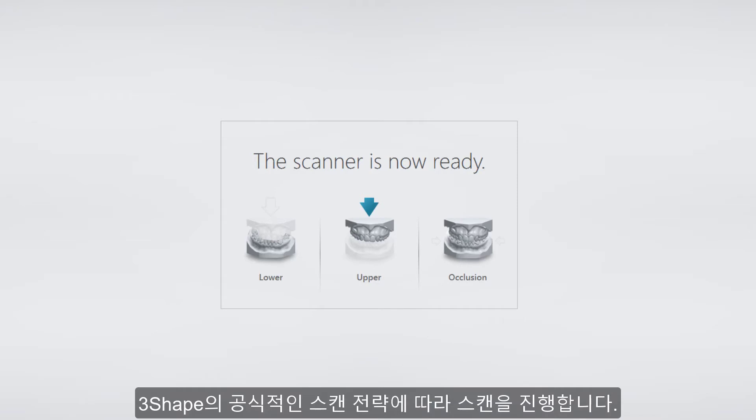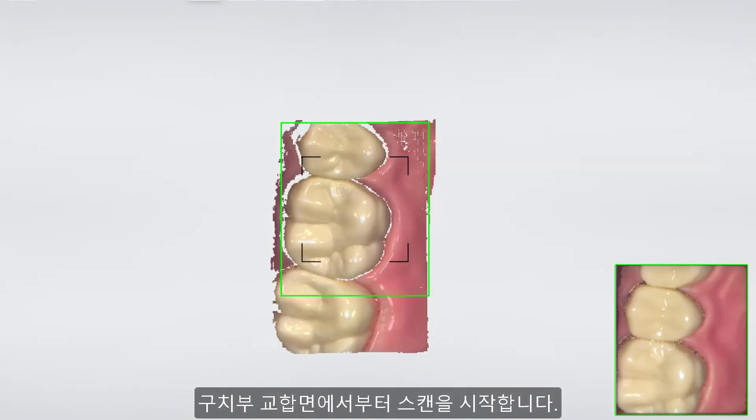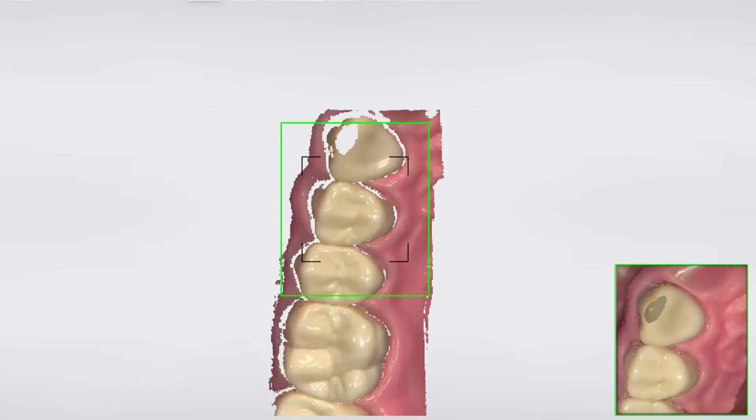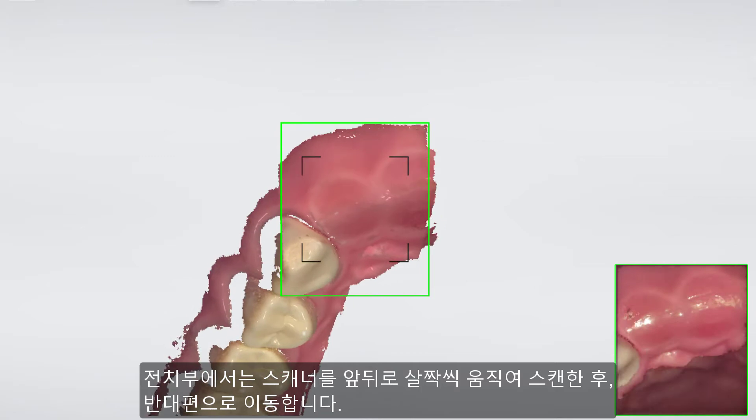Start scanning using the official scan strategy. Start from the posterior area on the occlusal surface. Wiggle the scanner at the front area and move to the opposite side.